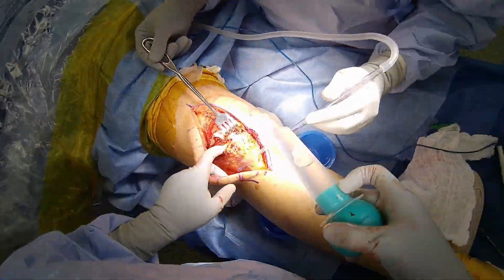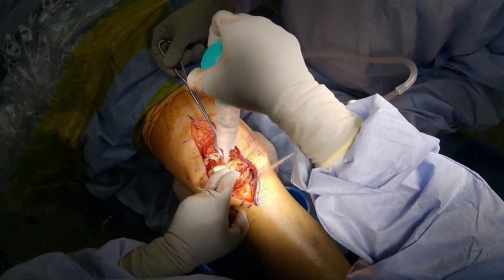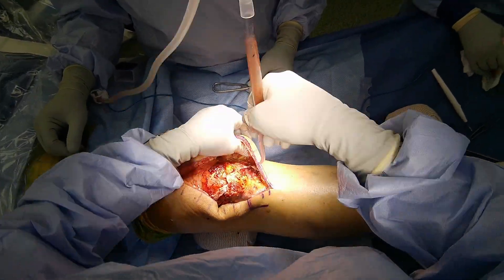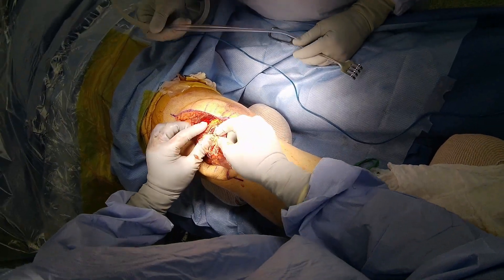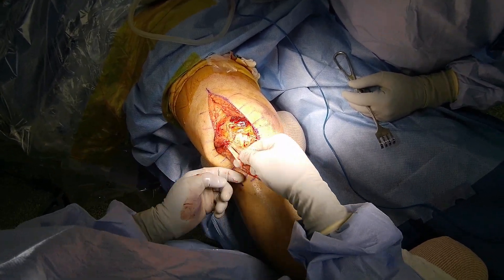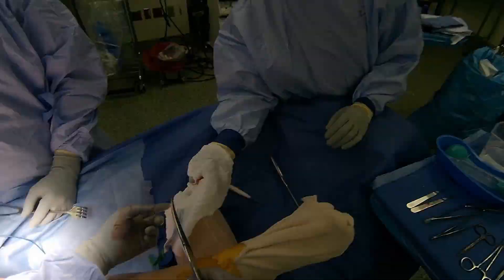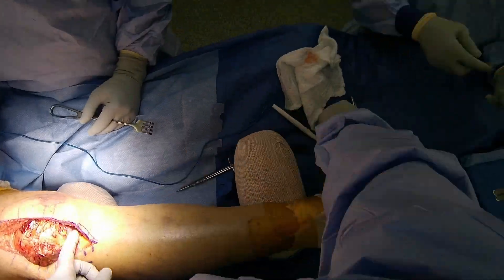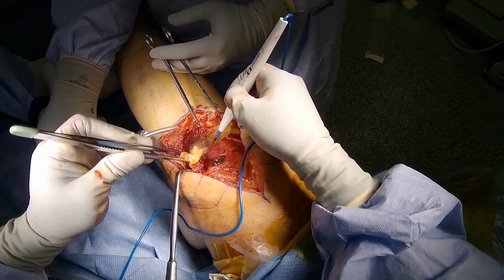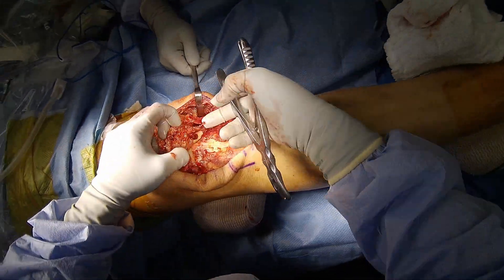Now that I have exposed the patellar tendon rupture, I will retract the patella and irrigate debris to further improve visibility. I then spend some time to elevate the injury itself and remove any badly injured tissue that I think will not help the healing process. The fat pad is also removed. Here I am nibbling the distal edge of the patella in order to expose fresh bleeding bone to which I will eventually repair the patellar tendon.